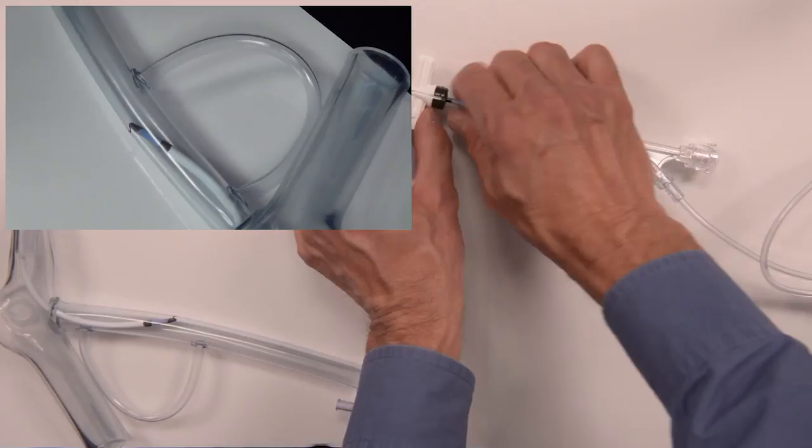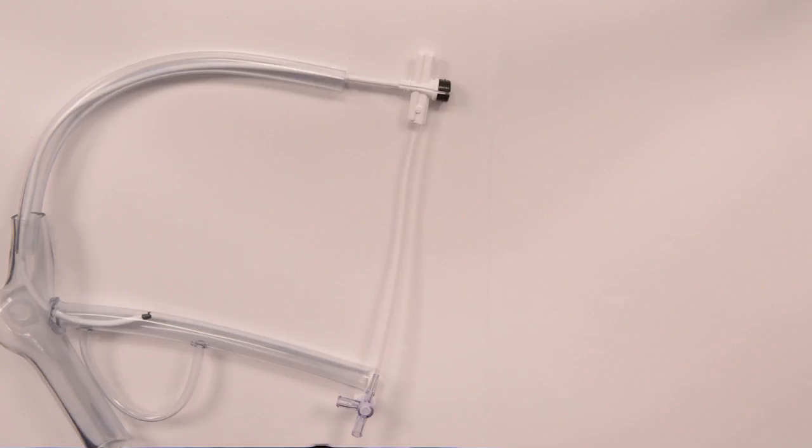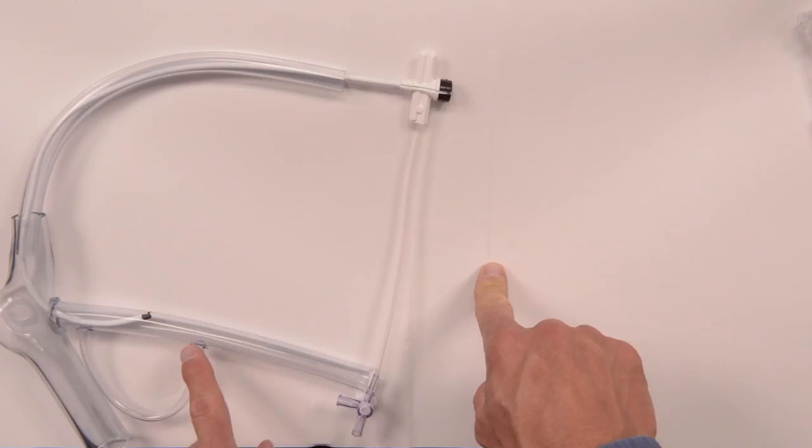Once we're done, we can just remove the braided core. Typically at this part of the procedure a venogram would be shot by the physician using a balloon or sometimes not. That allows us to identify the vessels, and we're going to say that this is a great posterior lateral branch that is going to be our target vessel.